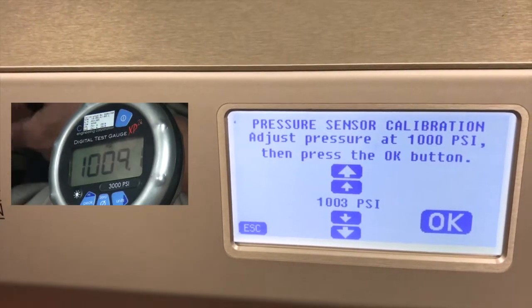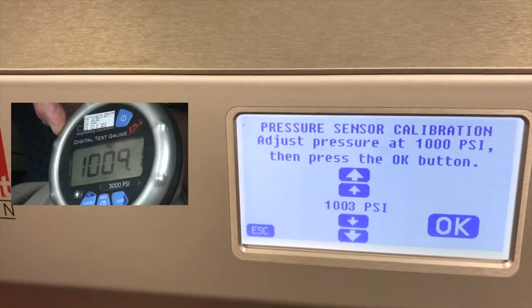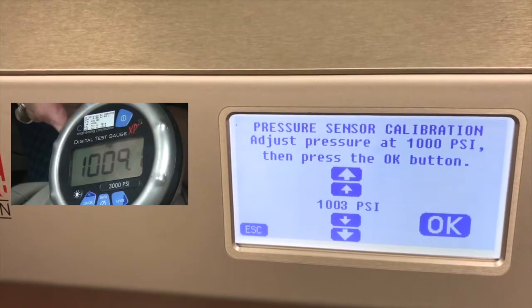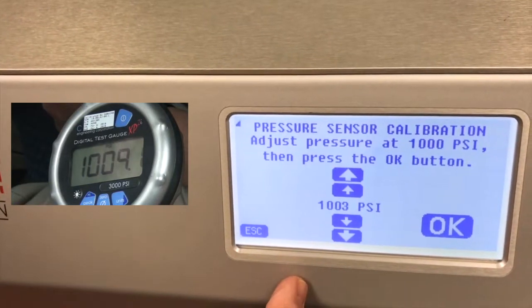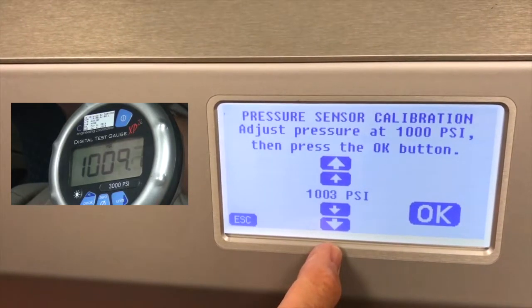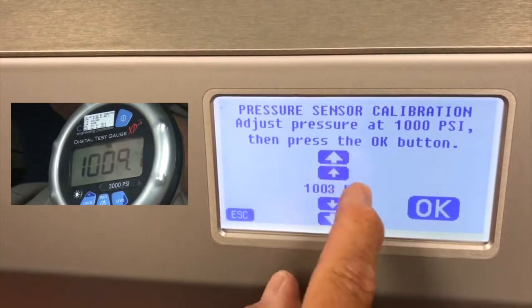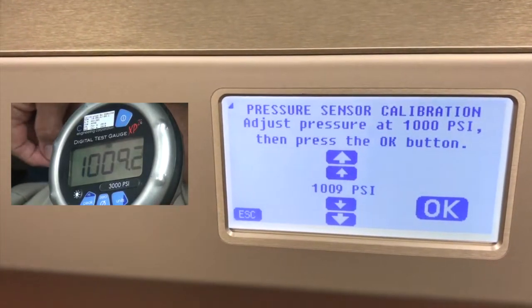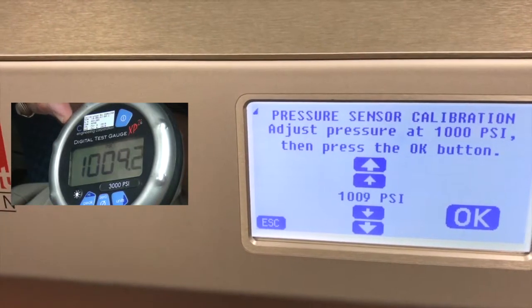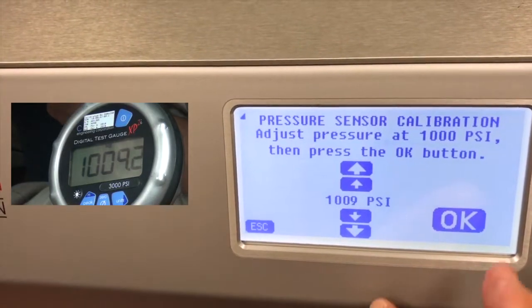We have arrived at maximum pressure. The HBLT says 1003 but my gauge reads 1009. What's most important here is to make these two numbers agree. We do that by using the up and down arrows on the HBLT to change the HBLT pressure reading to equal the external gauge. I hit the up arrow and it went to 1009, and my external gauge says 1009.2. I'm going to say that is OK — that's good.